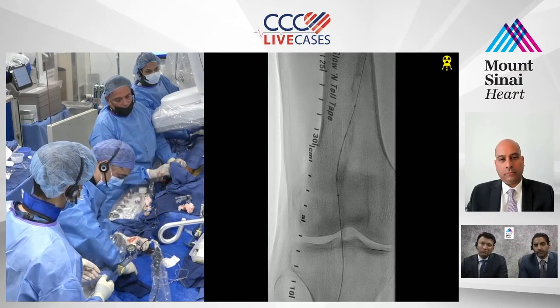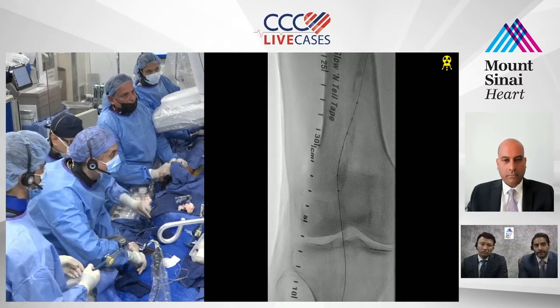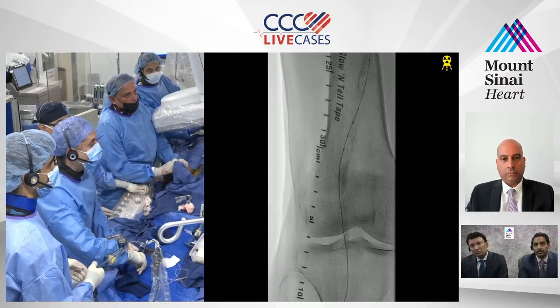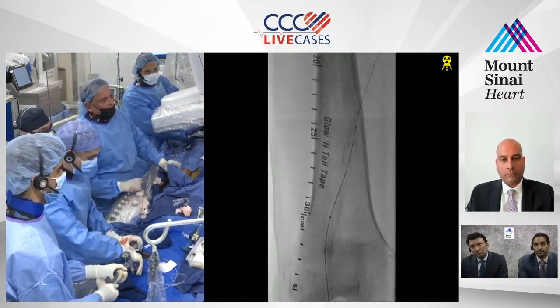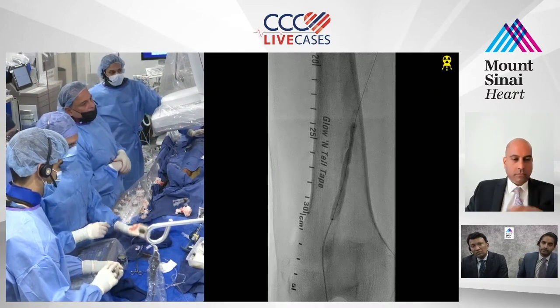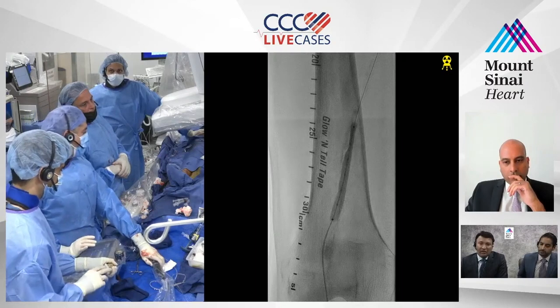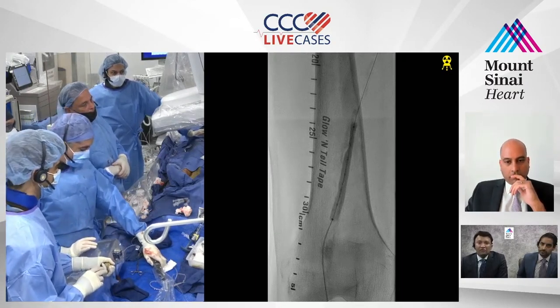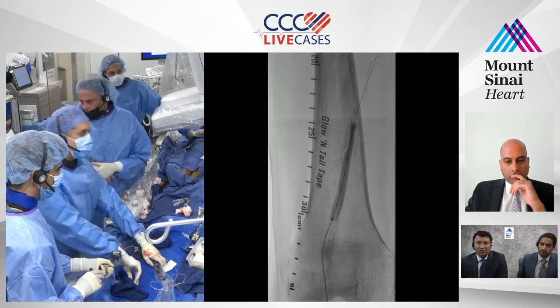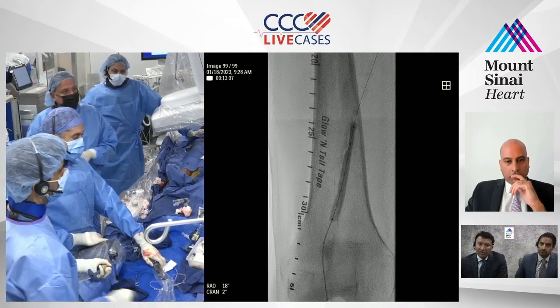It has a much more well-defined niche in the coronary realm. And for the uncrossable lesion where you can't get your delivery device, your wire, whatever you need across. Right. Non-dilatable focal lesion. You can actually laser blast it to create a lumen, and then take smaller caliber balloons, and then you crank it. As a primary atherectomy device, I don't think I've had any success, but when I couldn't cross, take a smaller laser device, blast it, and then upgrade it to, you know, a rota or something, it helps. Yeah. But I've never primarily had a success in calcium and laser.